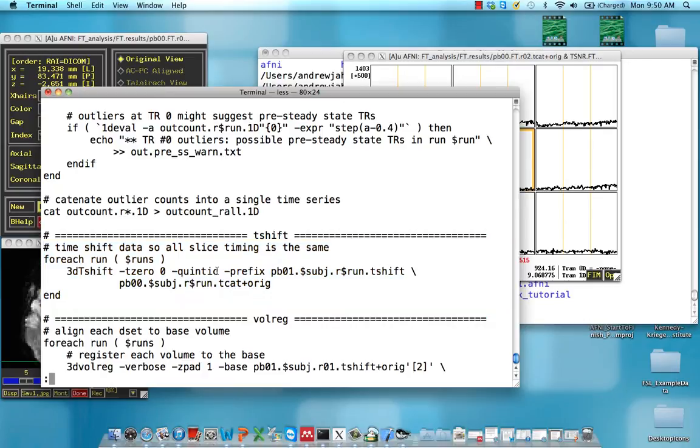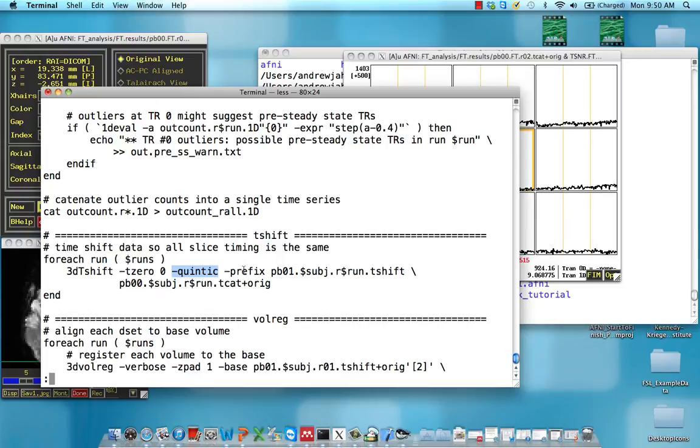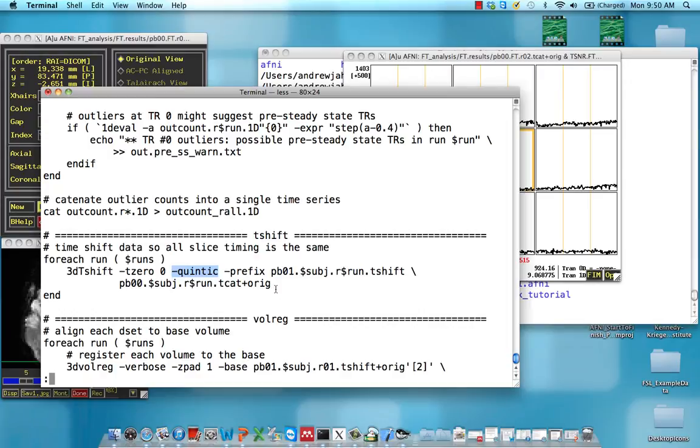Use a certain level of interpolation. This is quintic, so it's a fifth-order polynomial. And then give it this name for the output, pb01, with the t-shift appended to it. And we're inputting this tcat dataset from the previous block.